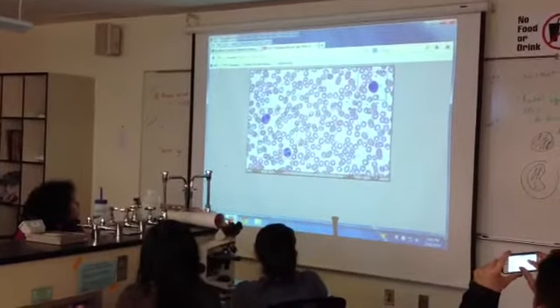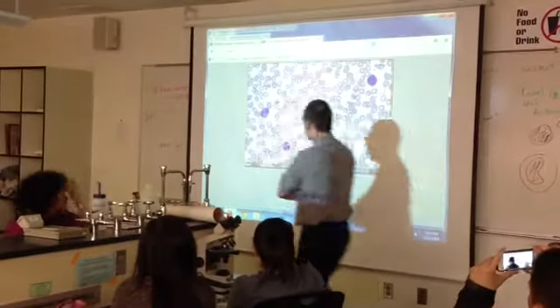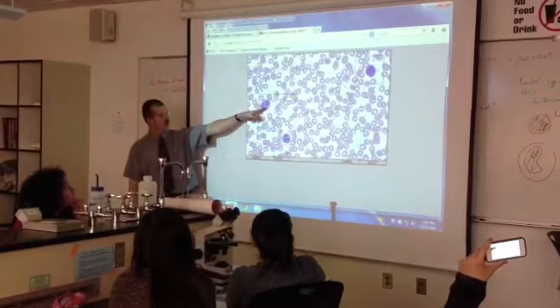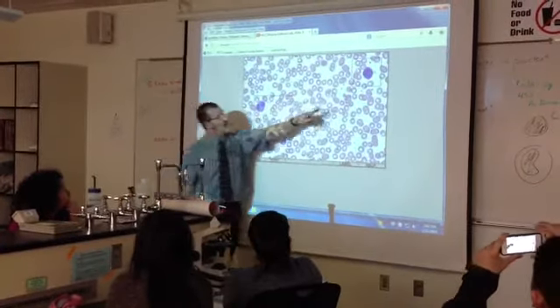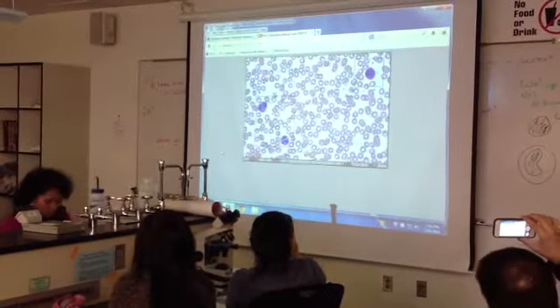All right. So this is using Boston. Let's go through these. These are all the granulocytes. I can tell they're speckled. Let's do Mr. Easy down here. Neutrophil. This one, that's neutrophil. Even though it's not red, you can see the speckles in the nucleus. Look at that beast up there. That's a basophil. They're very, very speckled.